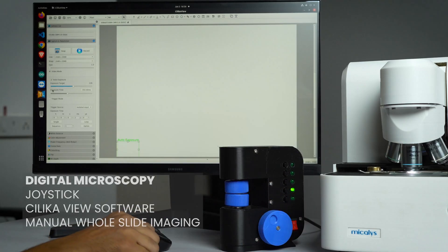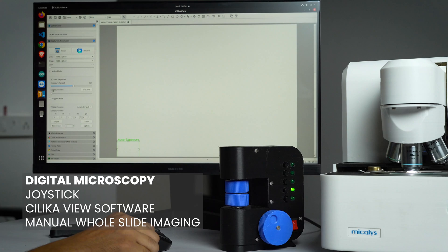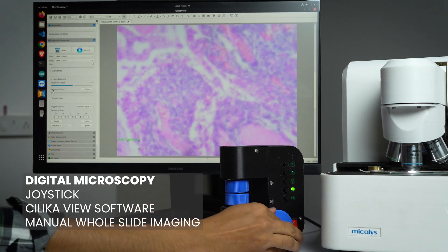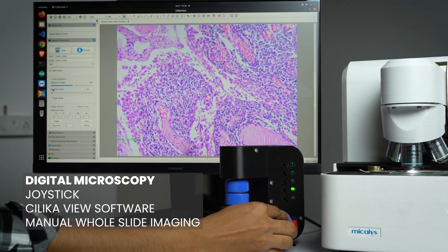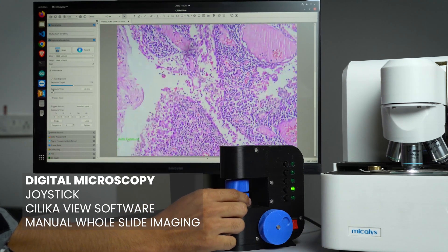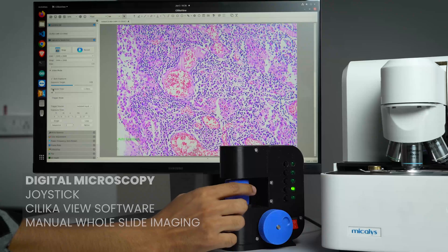Explore the world of digital microscopy with Micalys manual mode. Effortlessly navigate through your slides with our precise joystick interface.